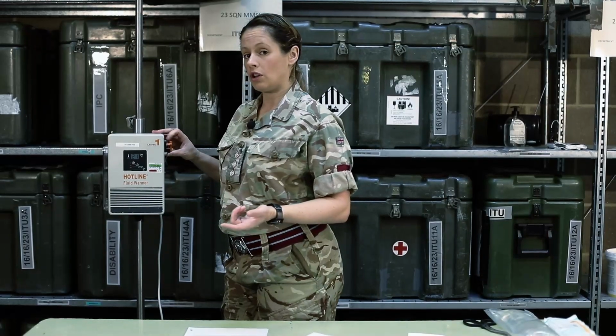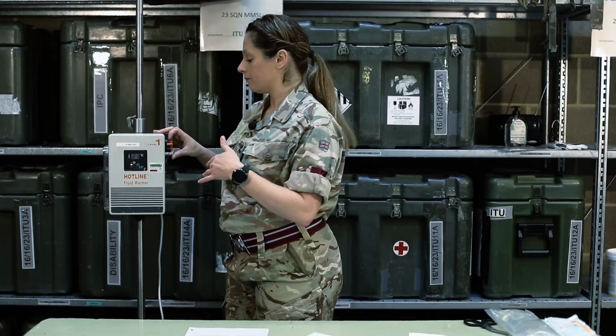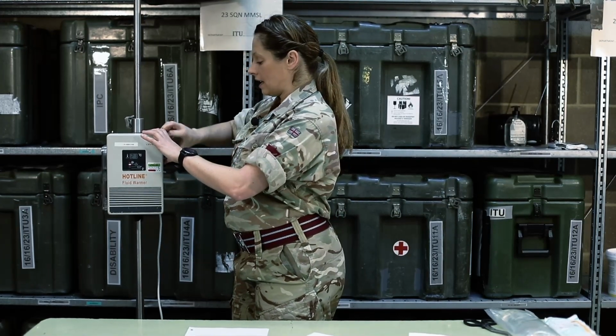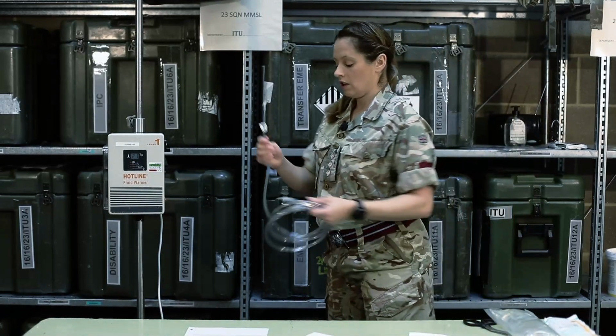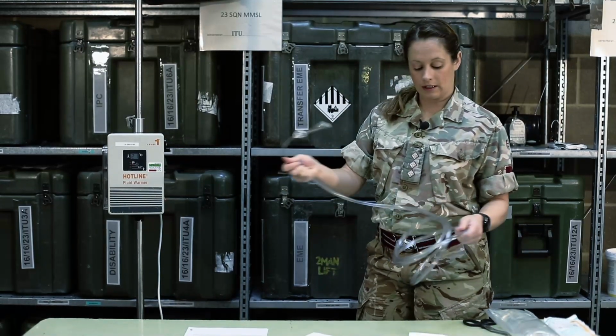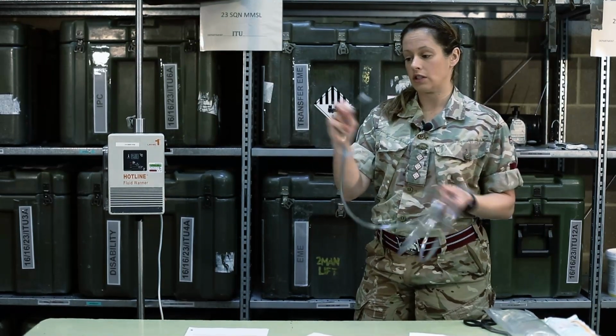Now we're just going to fill with the Hotline fluid warming set, and it'll alarm until you put a giving set in. So to do that, take this out. As you open your fluid line circulating set, there is a clamp at the top, so just clamp that.